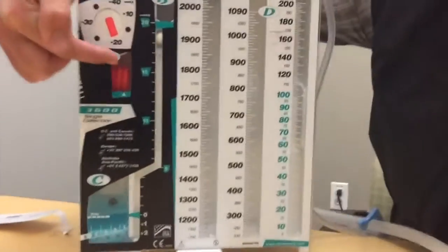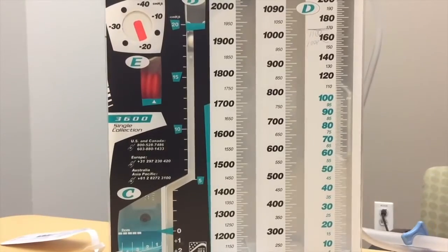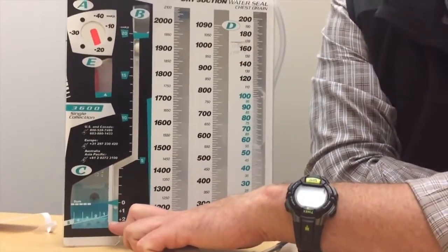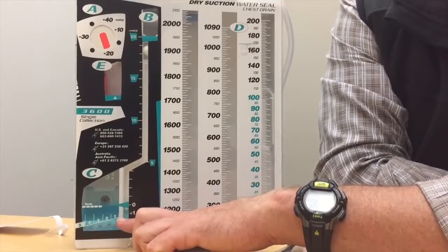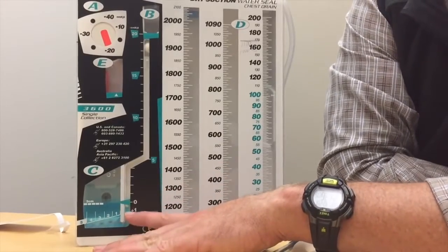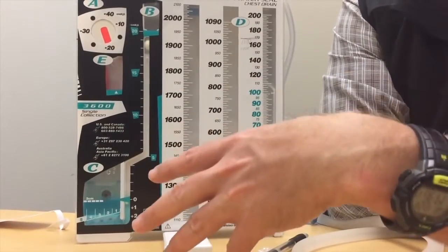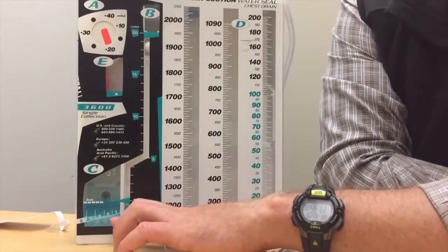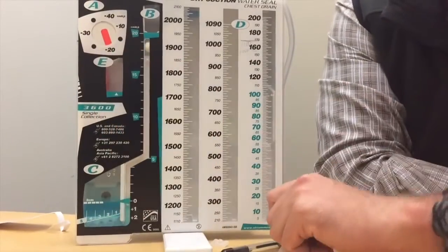Note that fully expanded bellows to the delta mark indicates a full minus 20 centimeters of water seal vacuum — what physicians typically order. Another sign that everything is functioning correctly is the float ball tidaling with each respiration, going up and down with the patient's intrathoracic pressures changing as the diaphragm drops. Normal tidaling and a gradual decrease in air leak are all good signs. Full bellows expansion at minus 20 centimeters of water seal means you're good to go.